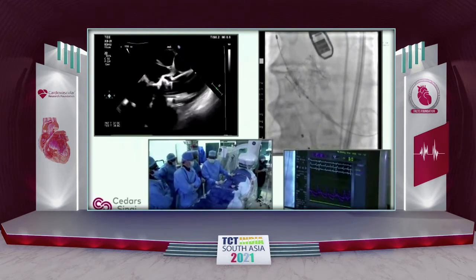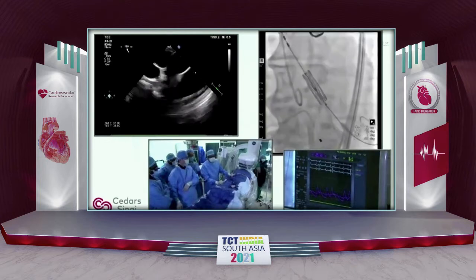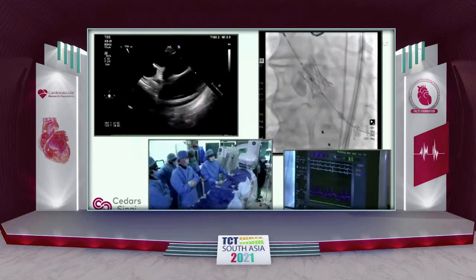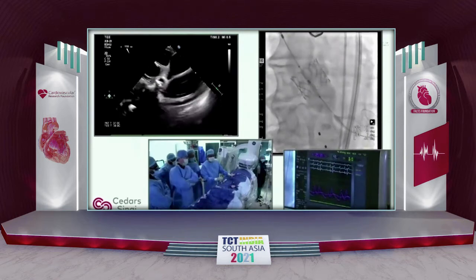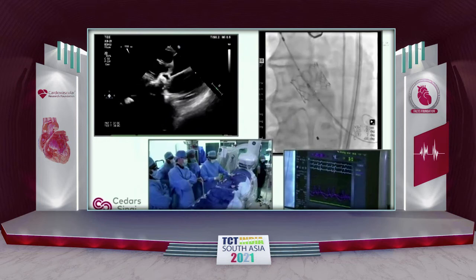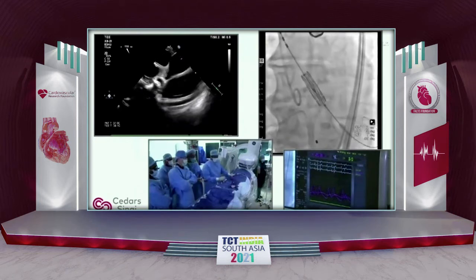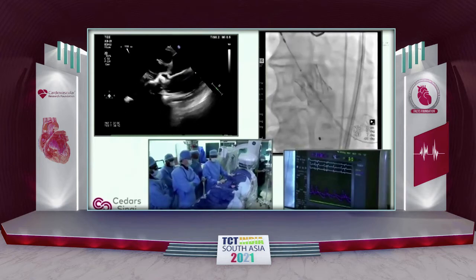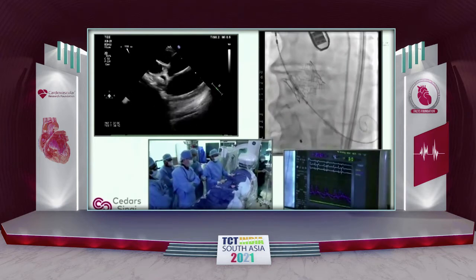Raj, do you believe in this visible line business, or do you position it on the marker? What's your experience? I just look at the valve itself. I don't look at the other things, the lucent line and stuff. Okay, so let's hope that this will not be counterproductive. Another balloon dilatation. All right, so balloon pacer on, please.